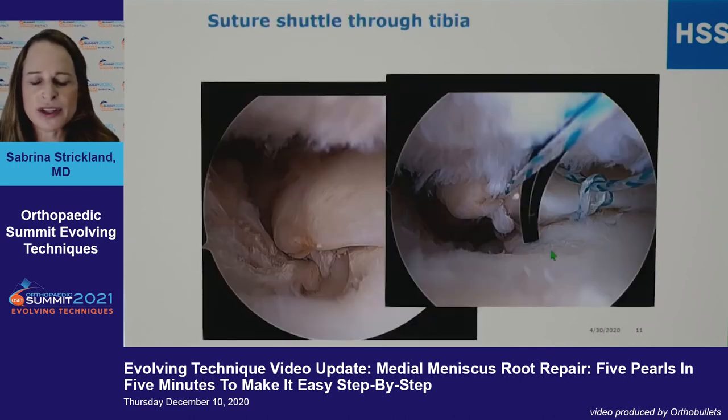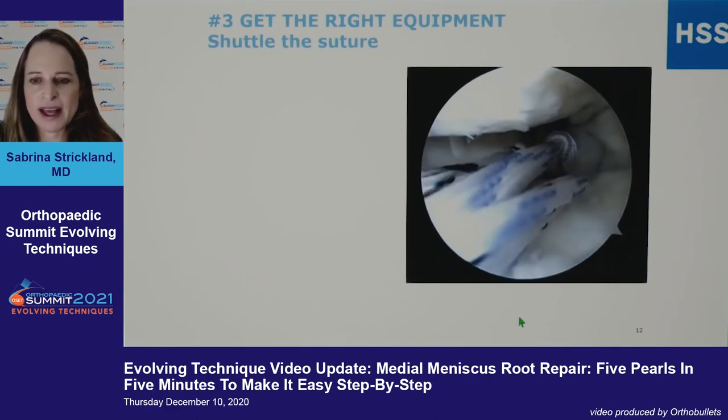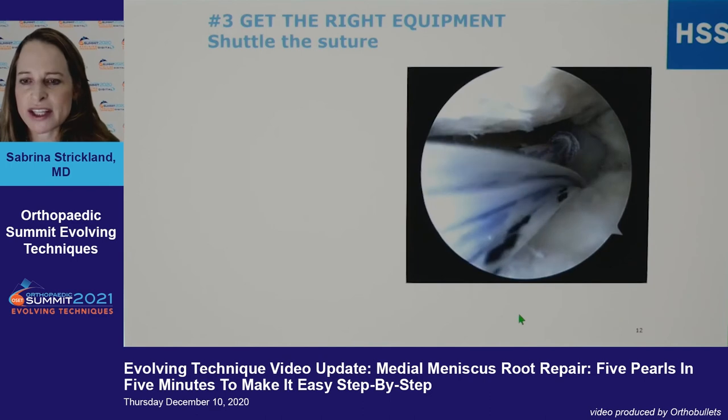When you shuttle the suture through the tibia, I pass the monofilament first and then pass my sutures back through. Here you can see it's nicely cleaned off. You really need to get the right equipment — here you can see the sutures being shuttled through.